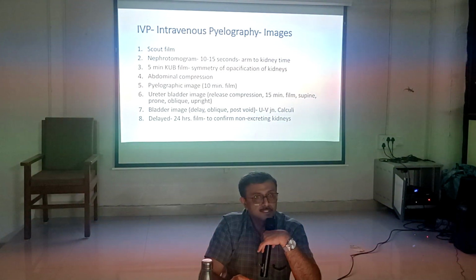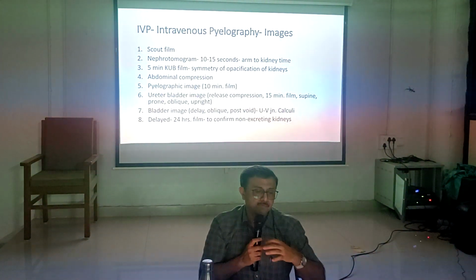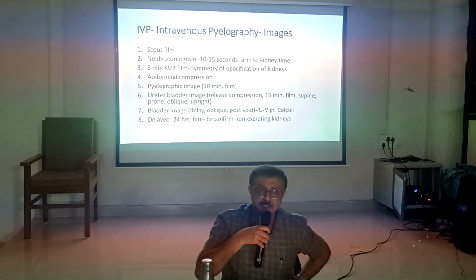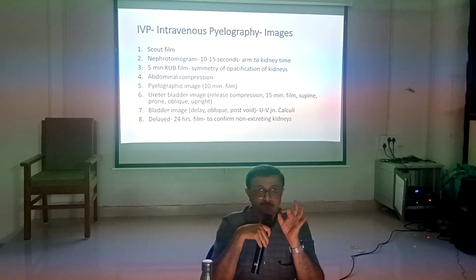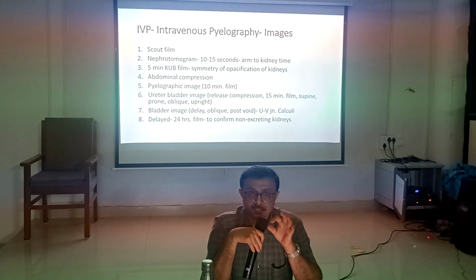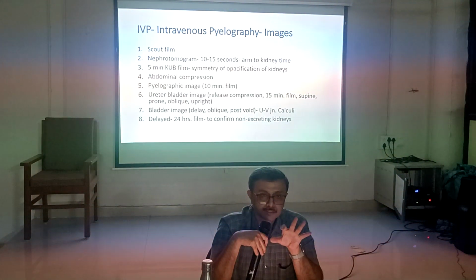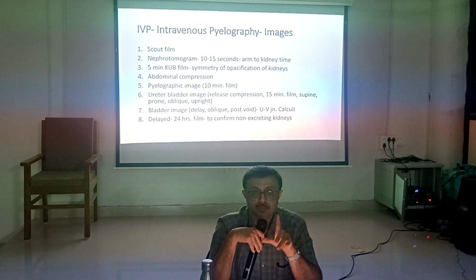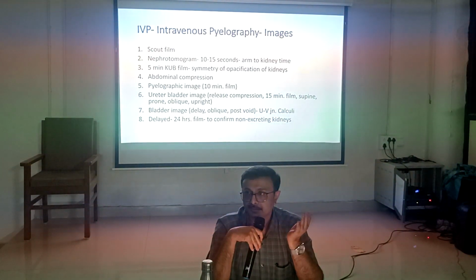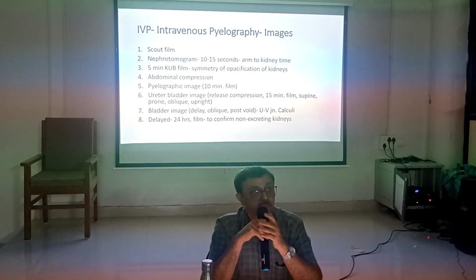Okay, how is it taken? Scout film, a plain film. Whenever we advise IVP for stone disease, it is always preceded by a scout film. And when we do surgery for stone disease, it is documented that IVP has been done. It is proven that the stone location is defined, even though we always advise a morning X-ray. Morning X-ray first, then take the patient, because stones are mobile.